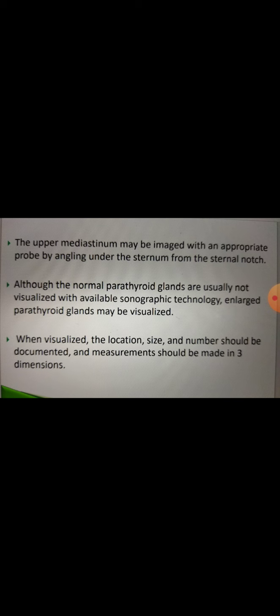And whenever the parathyroid gland is enlarged, just remember that it is best to assess it in the sagittal scans between the lateral lobe of the thyroid gland and the longus colli muscle.